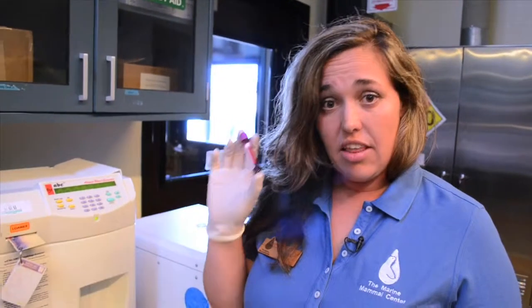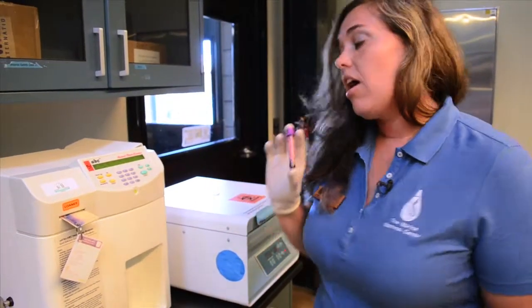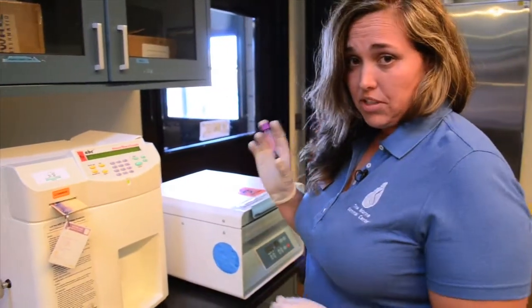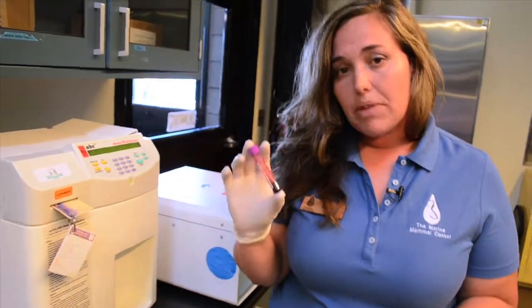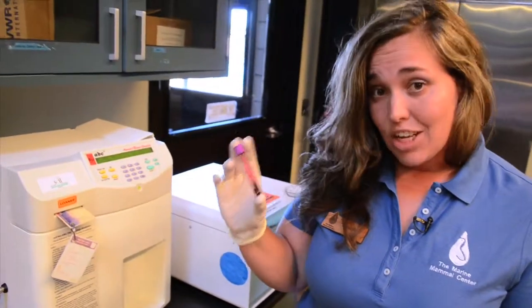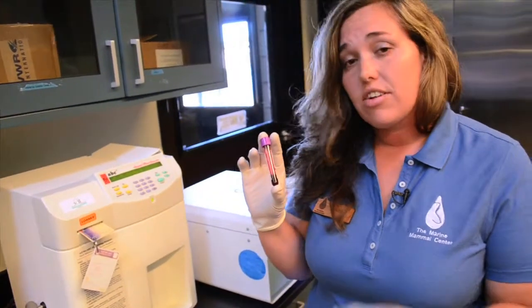Once we've collected the blood sample, we're going to put it into a machine to analyze it. The machine that we're going to put this blood sample into is called a hematology analyzer. It's going to give us a complete blood count — that includes the white blood cells, red blood cells, and platelets that are in the sample.